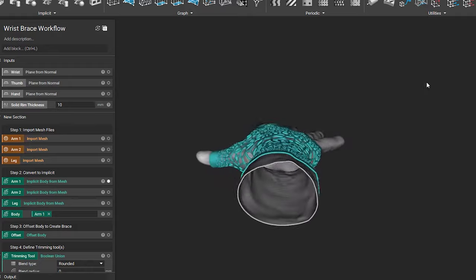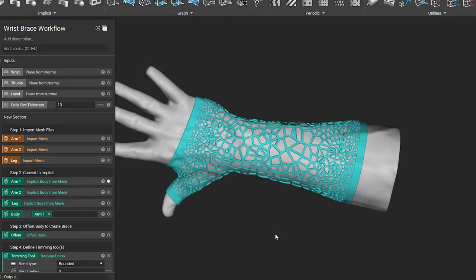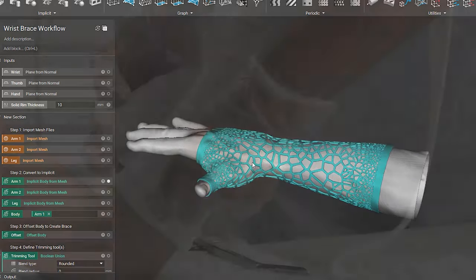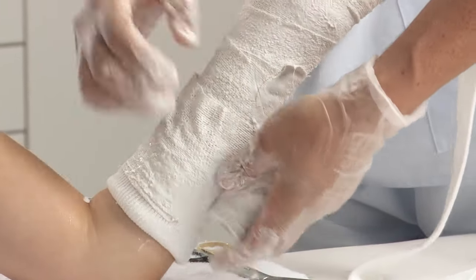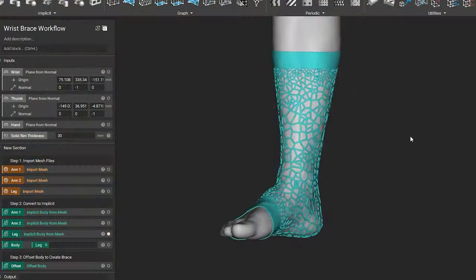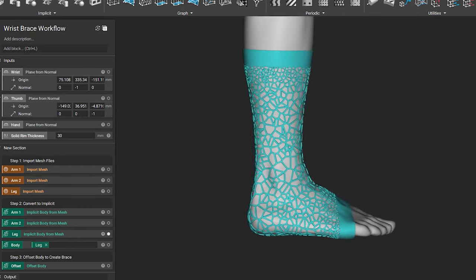Printed orthopedic casts are increasingly being used to treat fractures. However, the use of this technology has been quite limited. In a few minutes, we'll look at the advantages and the disadvantages of 3D printed casts compared to traditional plaster casts. We'll also look at what the future holds for this conservative, yet reliable and effective treatment method.